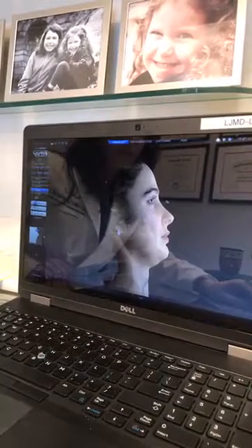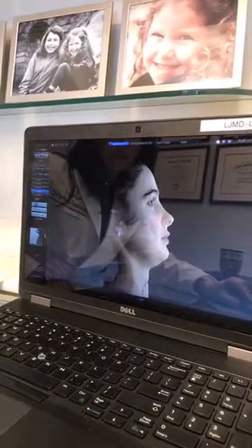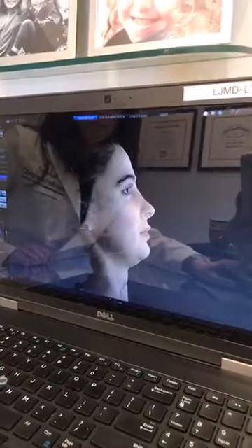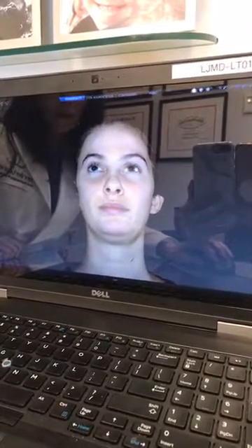If we wanted to show her how this would look at the nasofrontal angle that was a little bit low, we can take that up or down. We could also play around with her tip. If we wanted to make her nose narrower, we can narrow it there.